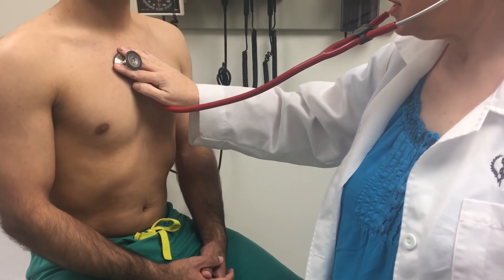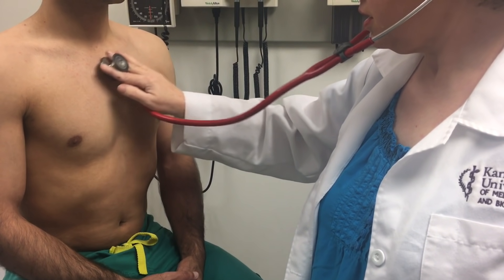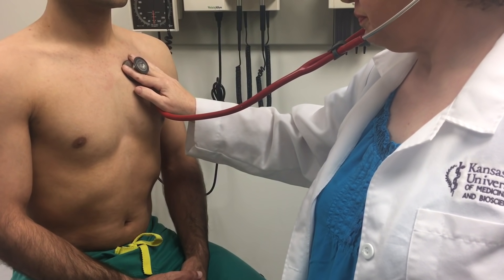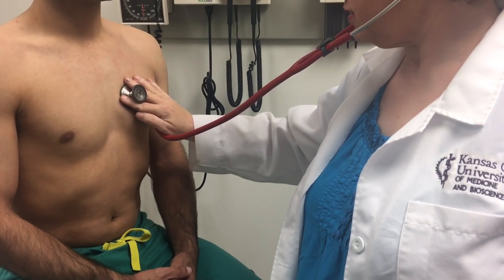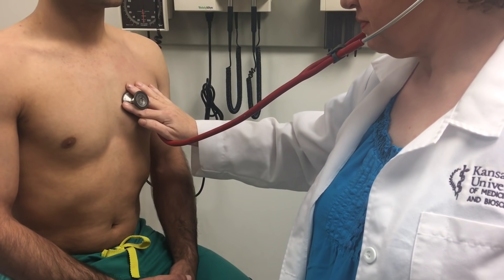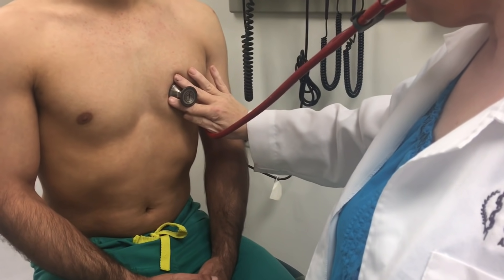To summarize: the aortic listening post is the second intercostal space just to the right of the sternum. The pulmonic listening post is the second intercostal space just to the left of the sternum. The tricuspid listening post is the fourth intercostal space just to the left of the sternum. And then the midclavicular line, fifth intercostal space for the mitral valve.